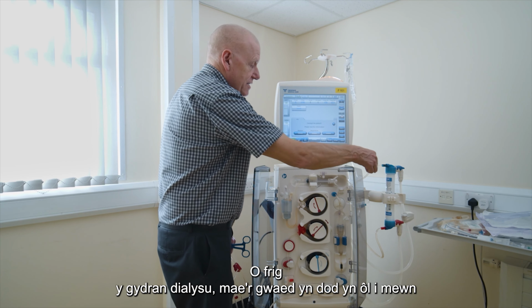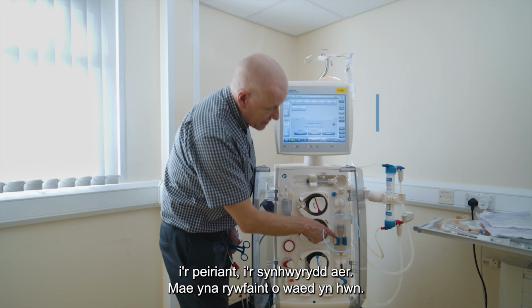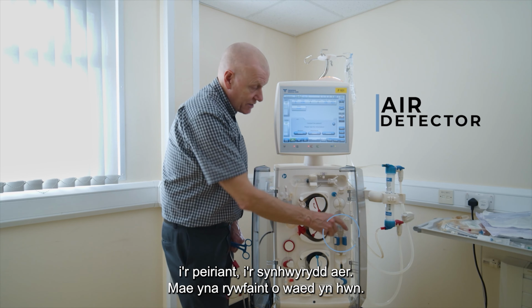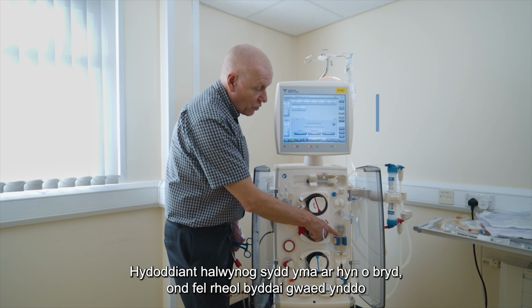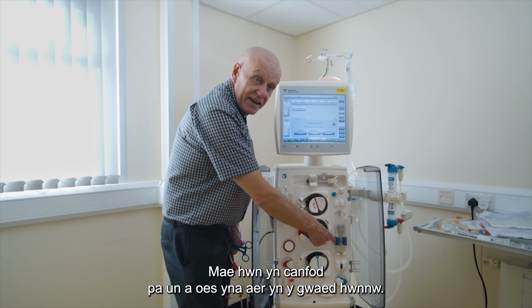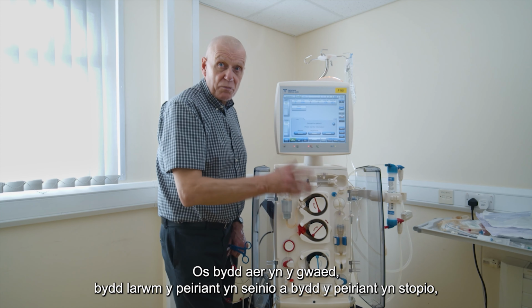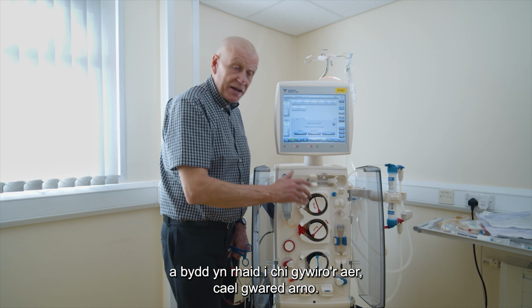From the top of the dialyzer, the blood comes back in to the machine, to the air detector. This has a level of blood within it. You can see saline at the moment, but normally there would be blood in there when you're dialyzing. This detects if there is any air in that blood. If there is air in the blood, the machine will alarm and stop, and you will have to correct that air, get rid of it.